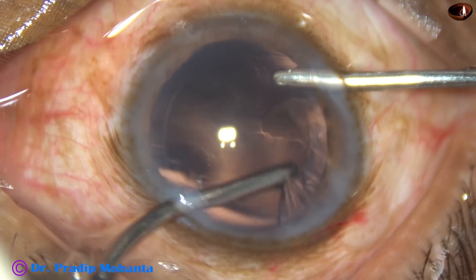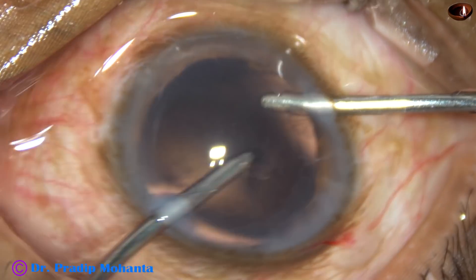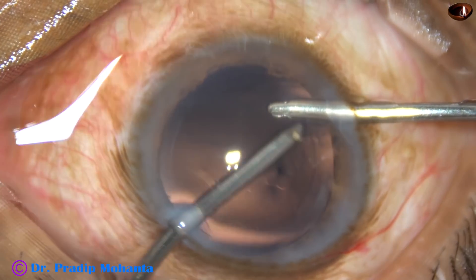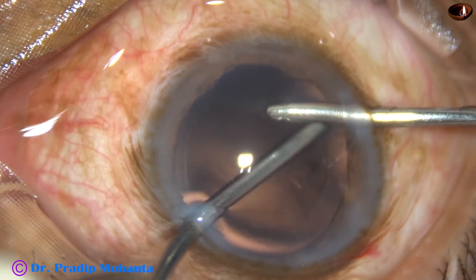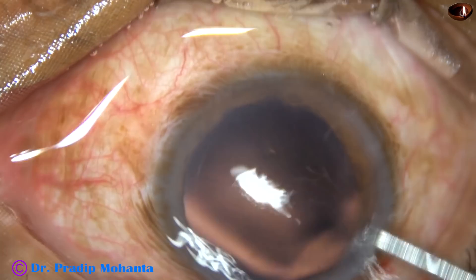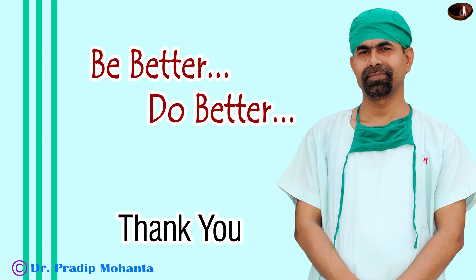After cortical cleanup by bimanual irrigation aspiration and posterior capsular polishing, a hydrophobic acrylic intraocular lens has been implanted in this case. Thank you very much for your attention. I hope this video will inspire you to try different techniques within your threshold of safety.